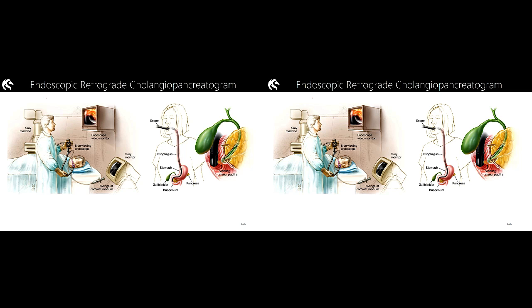The reason why we put the patient into an oblique projection is twofold. Reason number one, a 15-degree RPO will project the majority of the hepatobiliary contents off the spine.